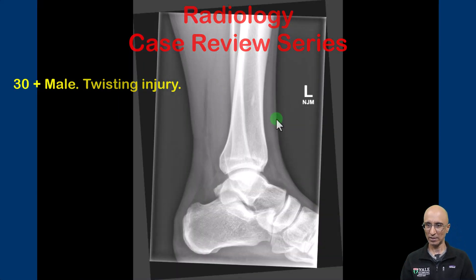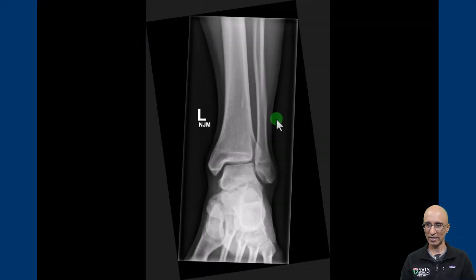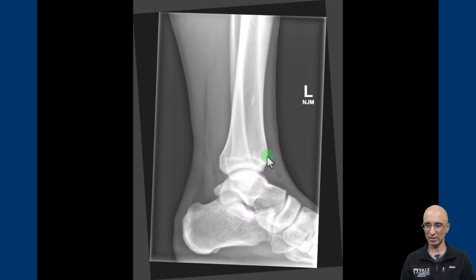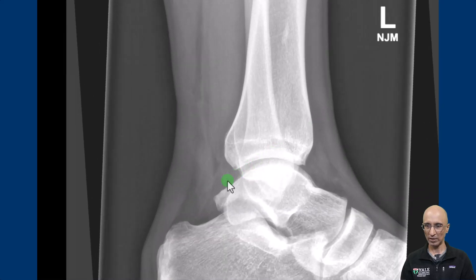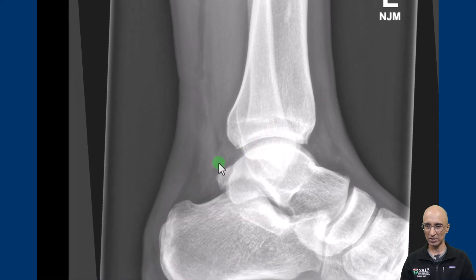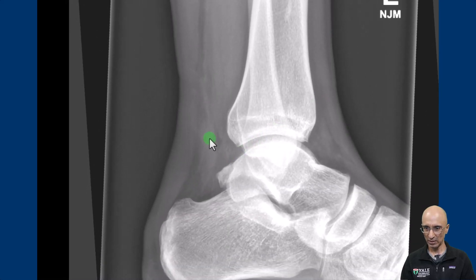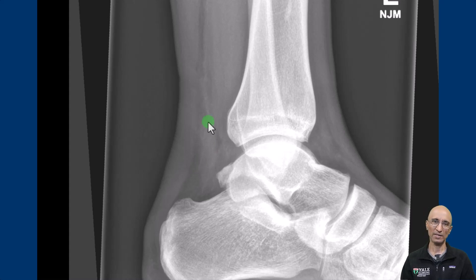On the frontal, oblique, and lateral images no fracture or dislocation was seen. On the lateral image — let me zoom in — you can clearly see edema posterior to the ankle joint and anterior to the region of the Achilles tendon. Based on these imaging appearances there was clinical concern for soft tissue injury, and the patient was referred for ultrasound examination.